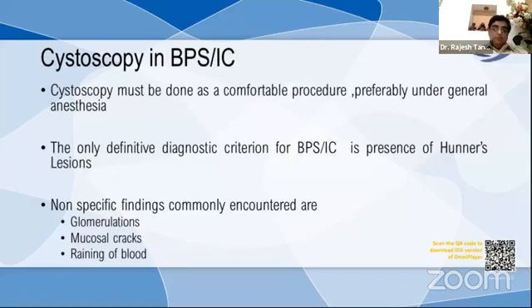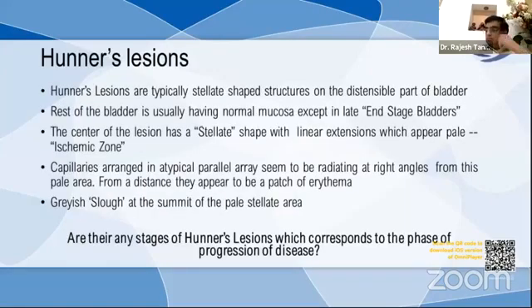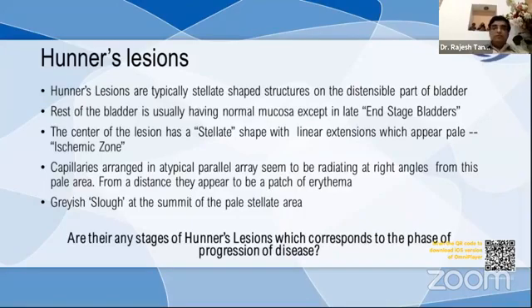Hunner's lesions are typically stellate-shaped structures on the distensible part of the bladder. The rest of the bladder usually has normal mucosa, except in late end-stage bladders. The center of the lesion has a stellate shape with linear extensions appearing as a pale ischemic zone. Capillaries arranged in an atypical parallel array appear to radiate at right angles from this pale area, appearing as a patch of erythema or grayish slough at the summit.